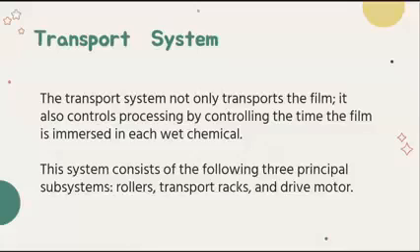Okay, but if your processing tank, such as the developer, is medyo deep siya, of course, your processing time is increased because it has to go through a deeper type of processing tank. Sige lang, later on, I will be discussing the processing tank, the processing rack, the transport rack, and the others.